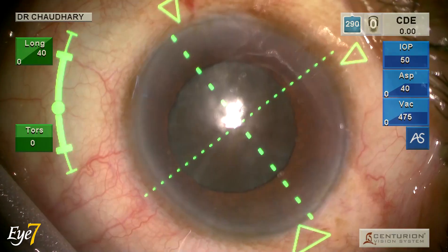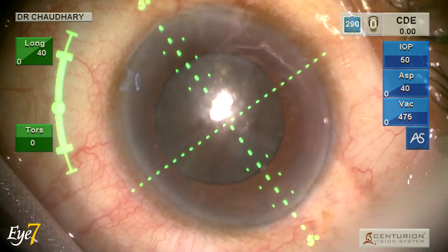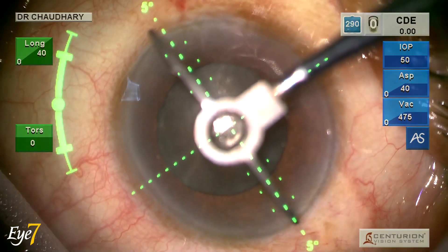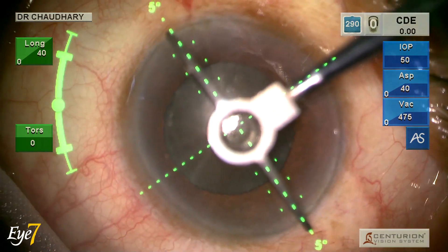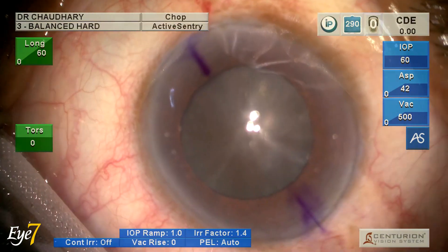First I have to mark the axis which is at 5 degrees, and this is being marked by a digital axis marker. I am confirming the axis with a gentian violet mark.